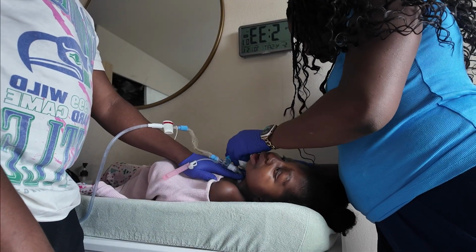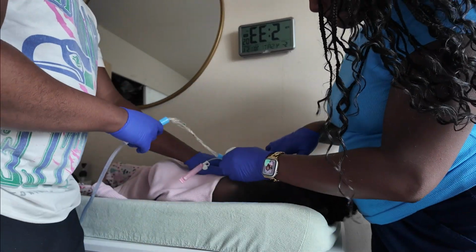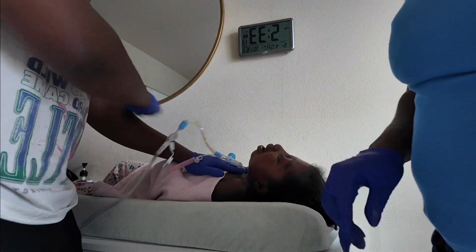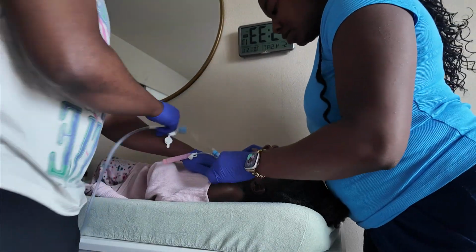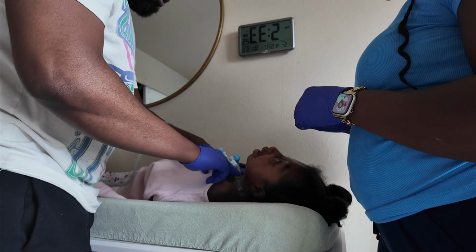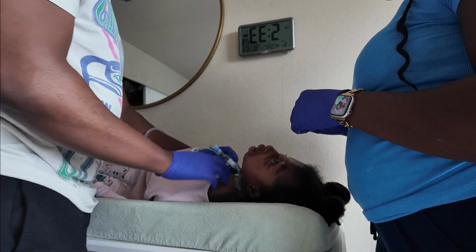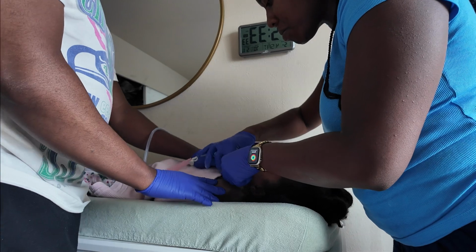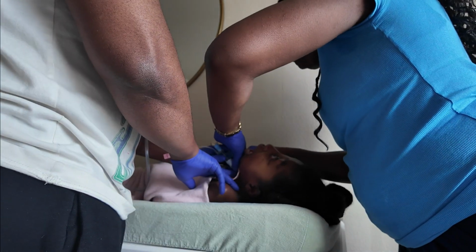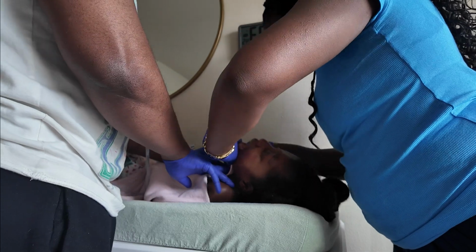So right now, Rome said I didn't have enough powder on there, so I'm adding more powder directly to her skin, and then we're going to put the dressing. So the dressing is the protective layer, so what you just saw, her trach, it's not digging into her skin. So the little flaps on each side, I'm pulling them up so I can get the dressing around so that area doesn't dig. She's coughing right now.